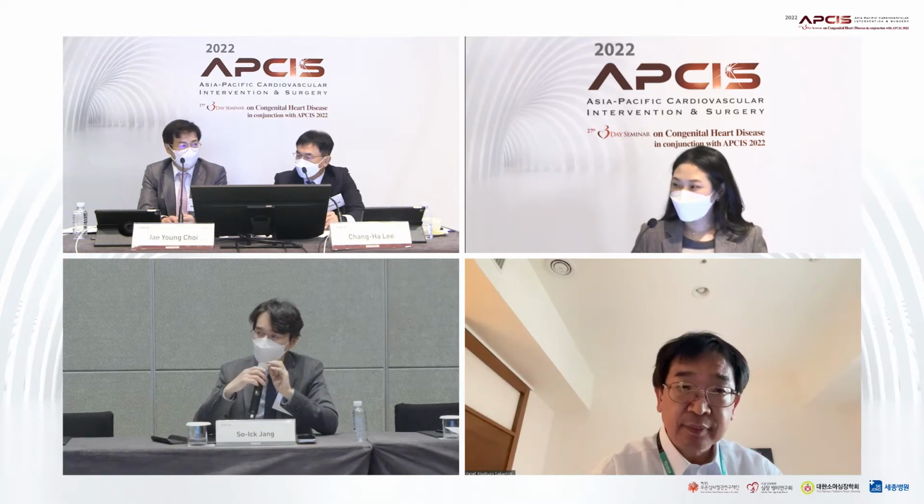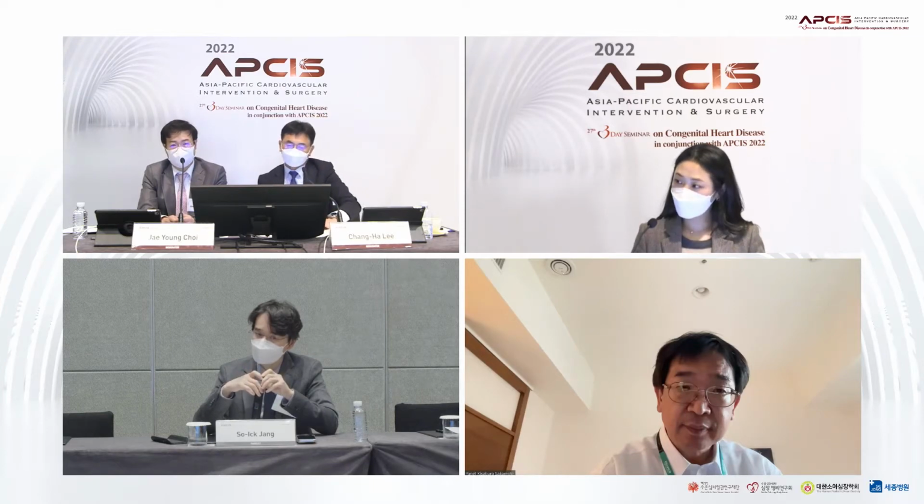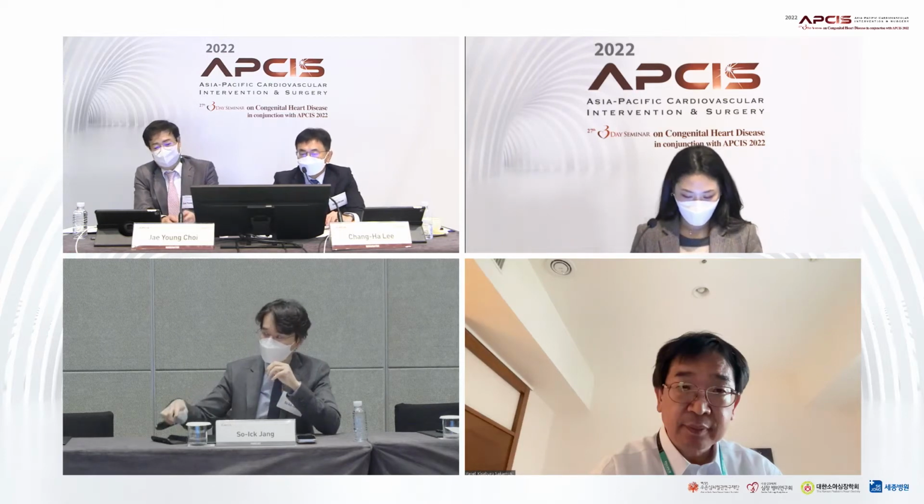What do you think, Jung-Yoon? Yes, I agree. But at the time, we had only medium size stents here, usually iliac stents, with a maximum dilatable diameter of 10 to 12 millimeter. That has been a problem for a long time in Korea. Yes. Let's move to the next part.